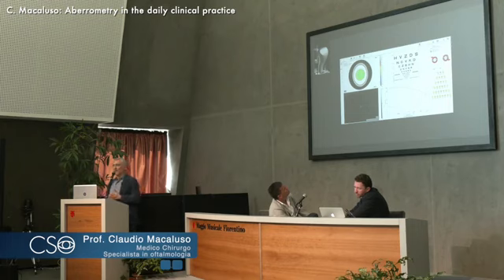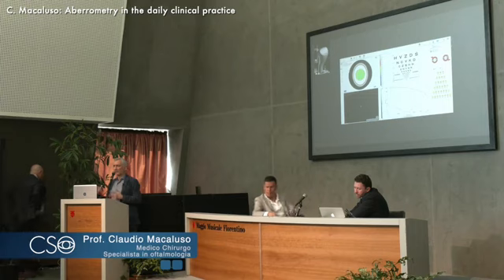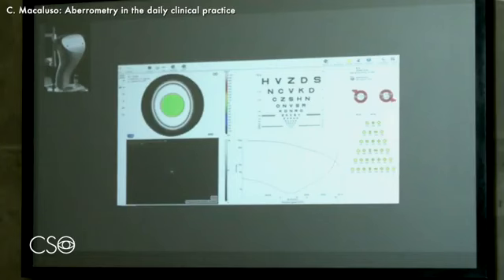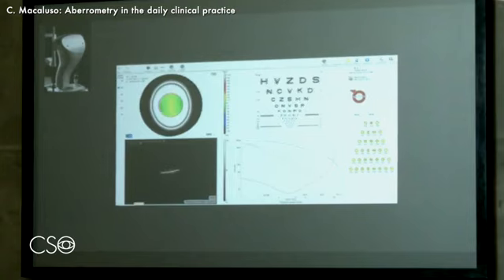And I find when I'm not finding an easy solution with the usual autorefractometer that the optometrist is using, going to this one, usually we get a better idea what is the best possible correction. We get some surprises. But the result you see is like before, the PSF is very good, vision is very good. This, to me, is beautiful.